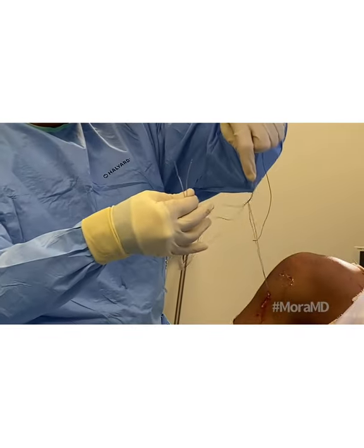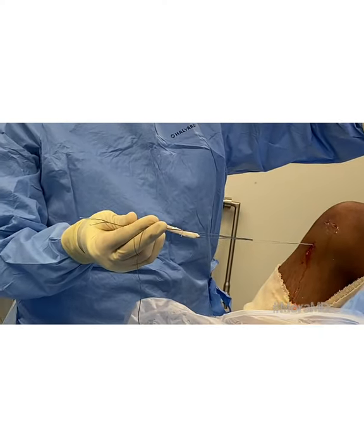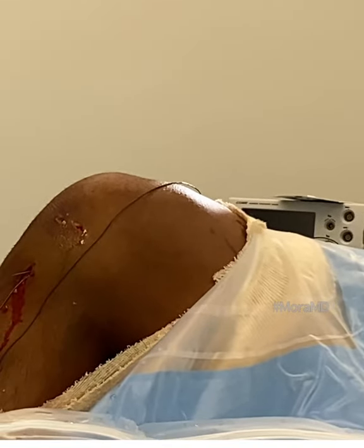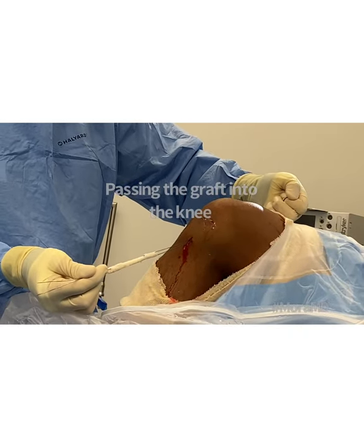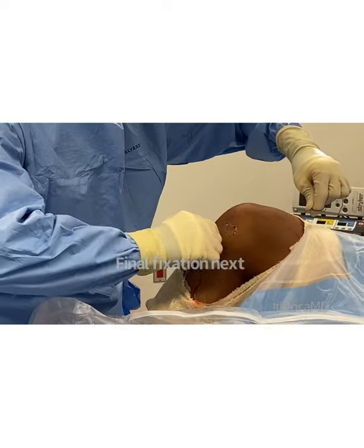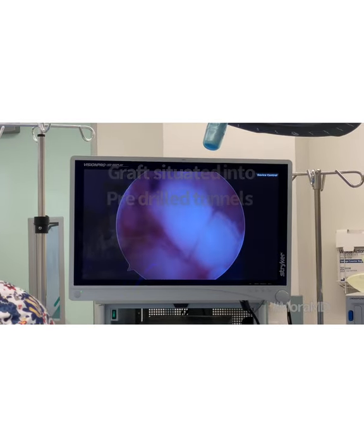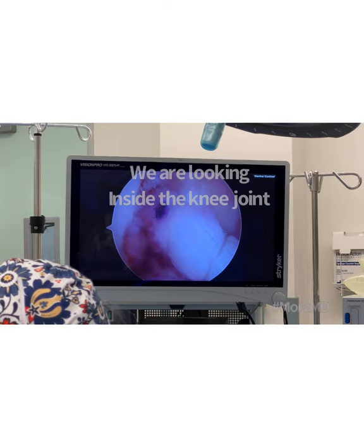I find it interesting — I put these two sutures in there, then pull my graft sutures in. Now I don't need the loop anymore, and now I'm going to use these two to pull it into the knee. The blue dot is almost at the entrance of the femoral tunnel — the graft is right there. I love the position — right in the middle of the tibial footprint. You can see that down there; it's already looking really nice.